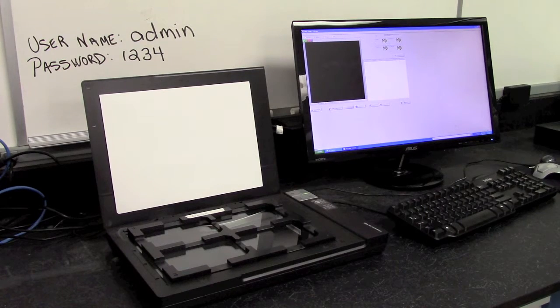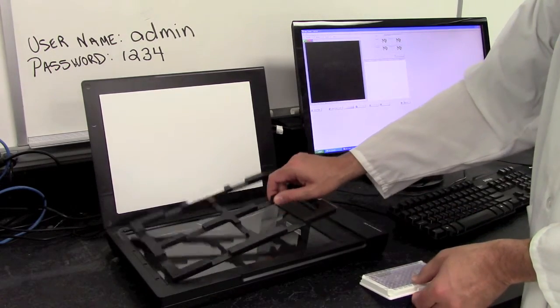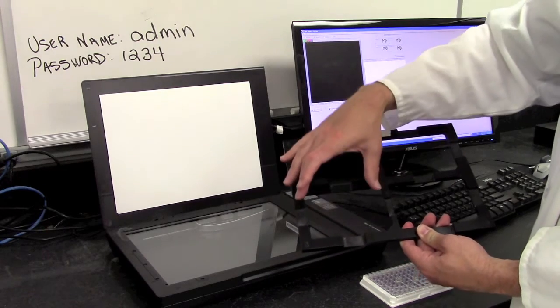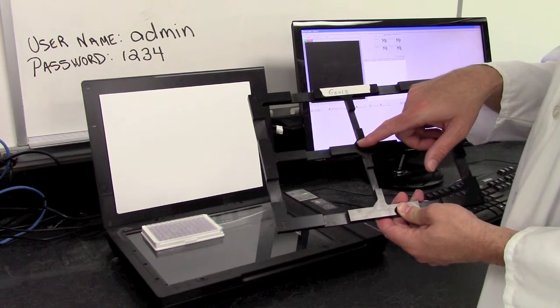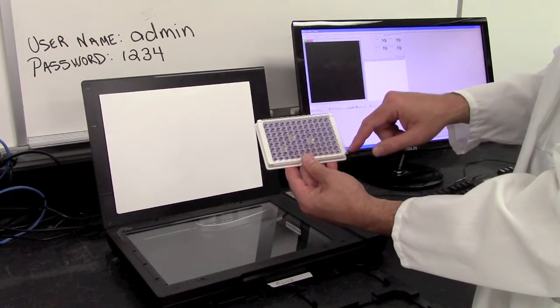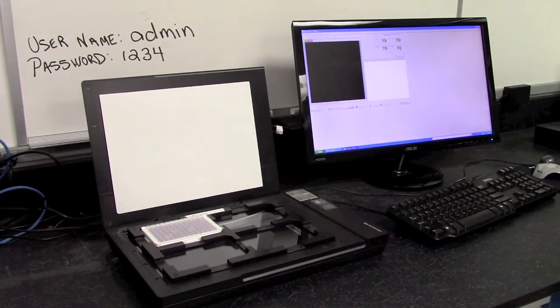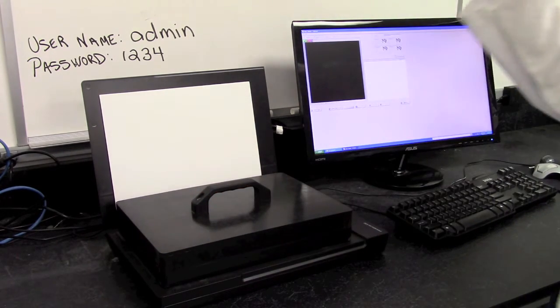Okay. So what we'll do is we'll take a completed plate that's been run. I'm just going to run one plate as an example, and the plate frame itself has numbers. So we're going to put the first plate in this top left quadrant, the second plate in the top right, the third in the bottom left, fourth in the bottom right. What we want to do is when we lay the plate grid over the plate, there's a beveled corner, and we want to align that with the beveled corner of your plate, and that way it'll sit properly over the plate. So place it down, align it in that bottom right corner, and then we're going to take the plate cover and cover that plate so that when we scan the plate, no ambient room light will interfere with the interpretation of your result.